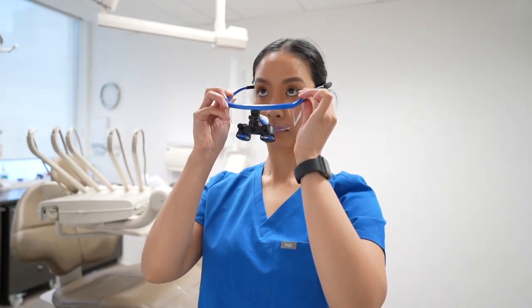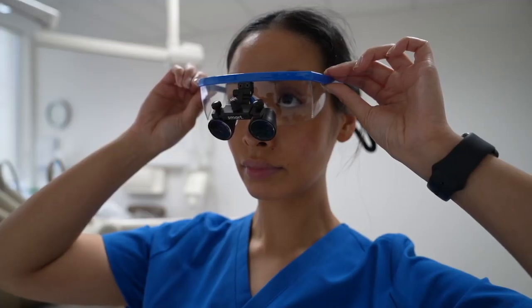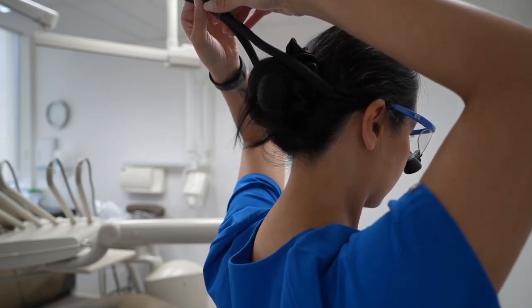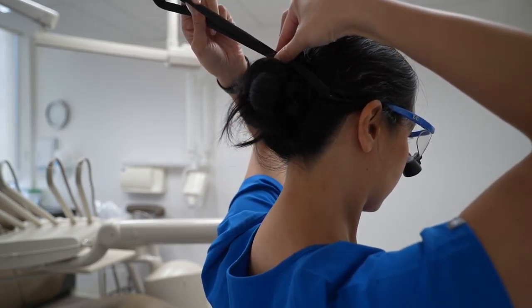Always use both hands to put your smart loops on and off. Slide them over your ears and lower the frame gently onto your nose. Pull the straps to hold your loops in place.